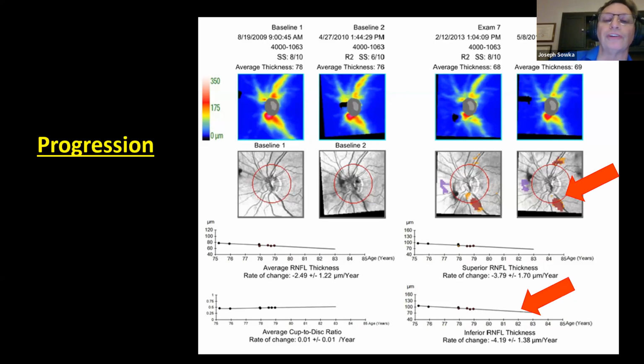And another question, Mike, do you ever recommend obtaining 2 baselines on the same day? If not, what is your time frame? No, that's a pretty decent way to cheat the system a little bit, is to take 2 OCT scans on the same day. You have to keep in mind that then your baselines are consolidated to a single day, but it does allow you to cheat the system and to get progression analysis a little bit more quickly.